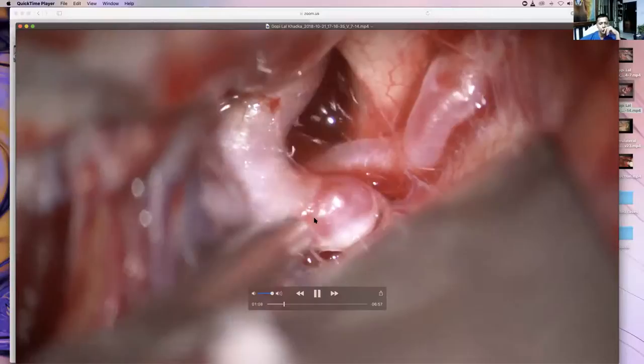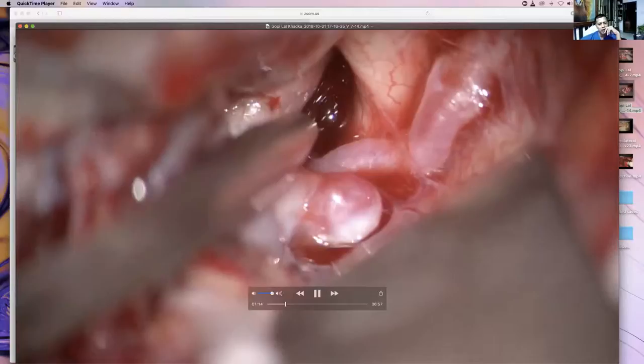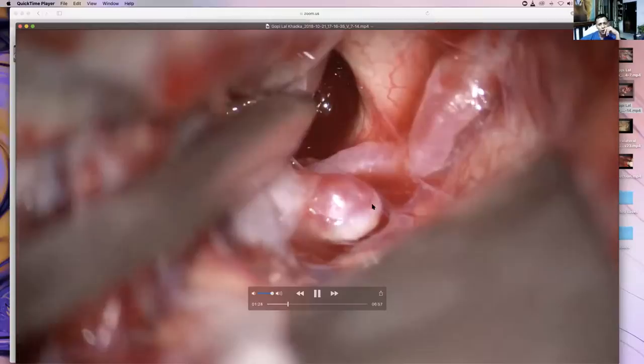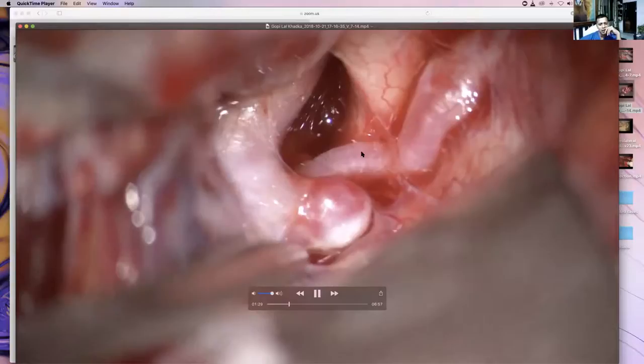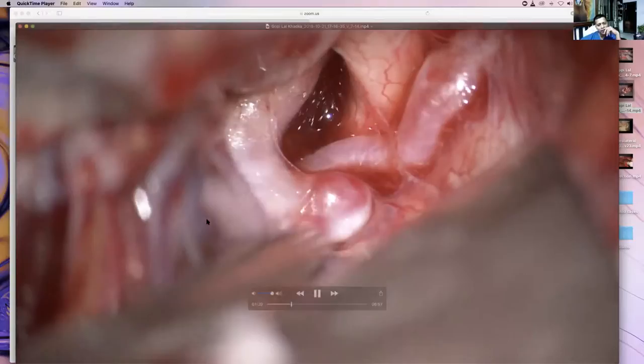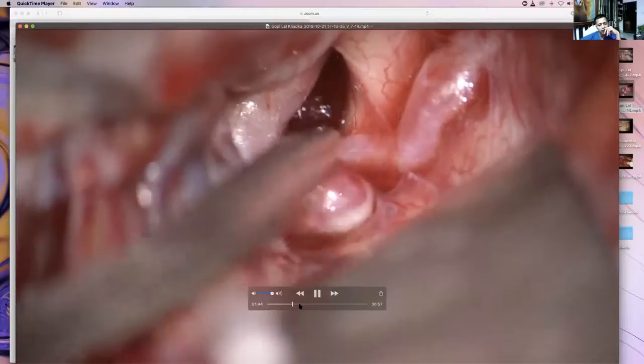This is the aneurysm that had bled. So the brain was really tight to start with. I wish I could show you. You can see the bleeding here. All the blood is here. It was all around blood. So we dissected everything, and we went ahead. And this is the optic nerve. That is the IC. That is the ACA. And the MCA is here continuing like that. The sylvian fissure, we opened proximal sylvian. And then we are cutting off all those arachnoid bands one by one, slowly making space for the clip.